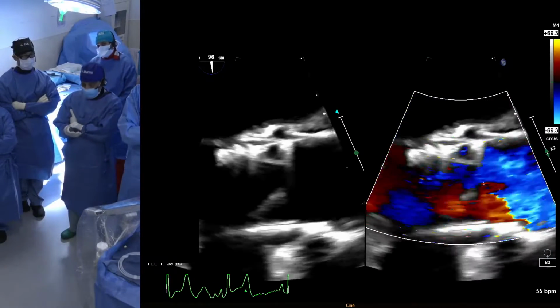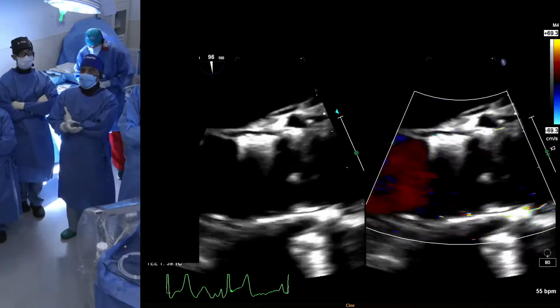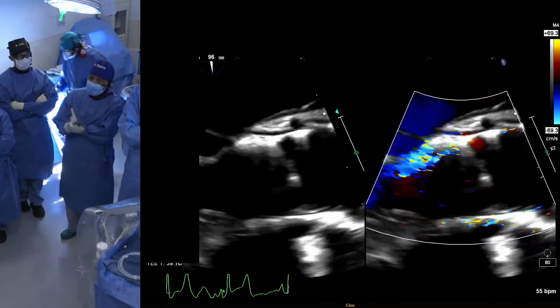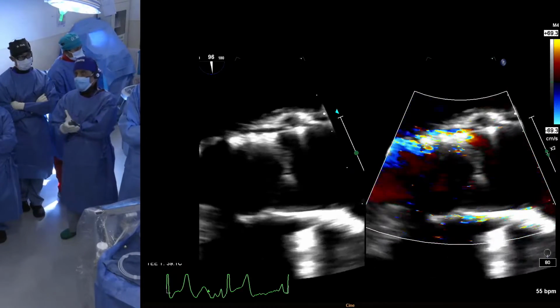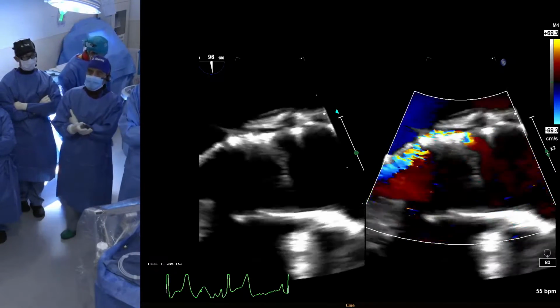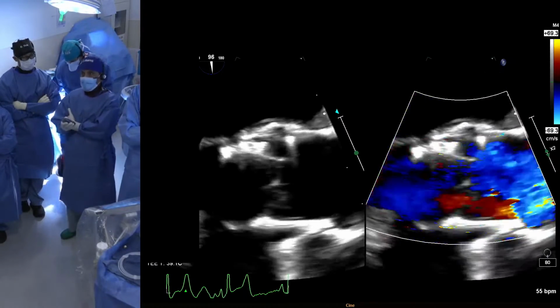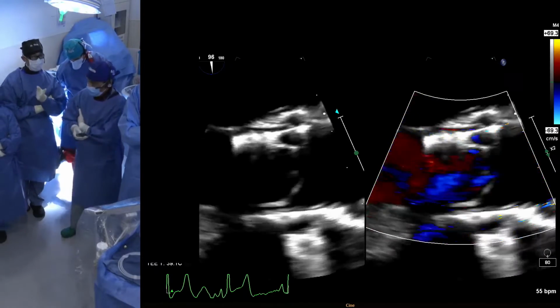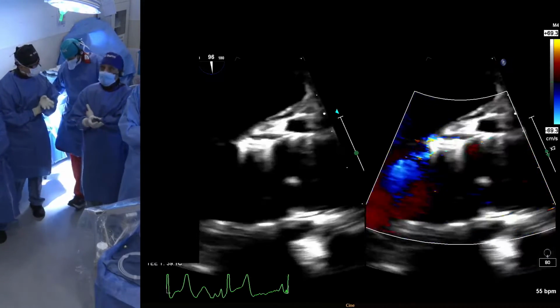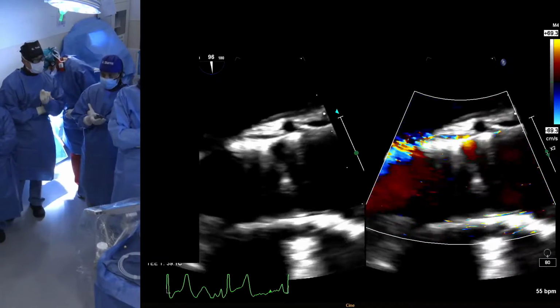I mean, regurgitation. Just coming back to the natural history of mild PVL, studies have shown that up to 5 years, 95% will remain mild. Some of them may even regress, particularly self-expanding, and only 4-5% will progress. So it's not common that mild PVL will progress. Mild we leave many times. Correct. But the issue now is that a lot of sites are not doing proper echo, and mild may actually be moderate, but underestimated.